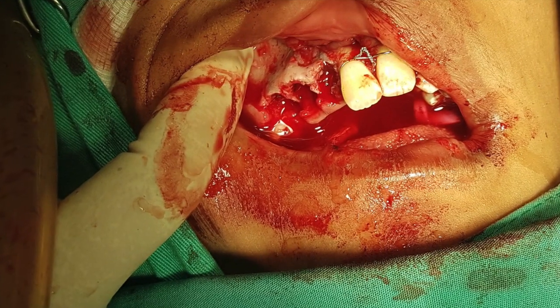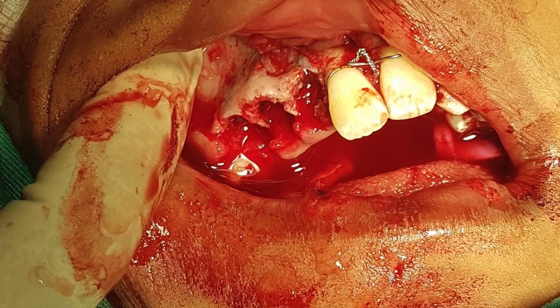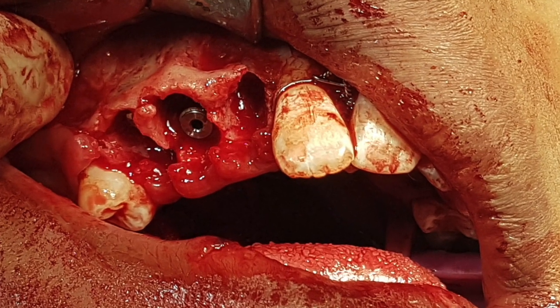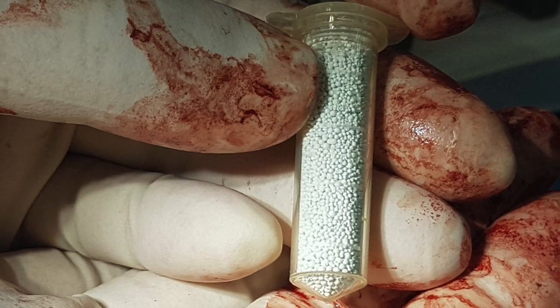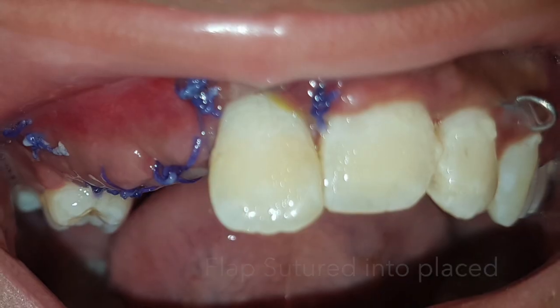As you can see here, the upper right central incisor is finally secured into place and there is quite good stability — at the same time it's not as rigid as you might think. Following stabilization of those two central incisors, we decided to place two dental implants into the existing socket, as well as putting in a little bit of bone graft.